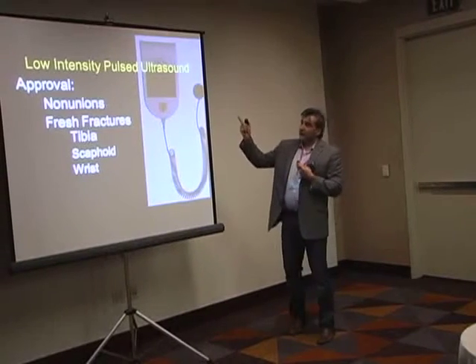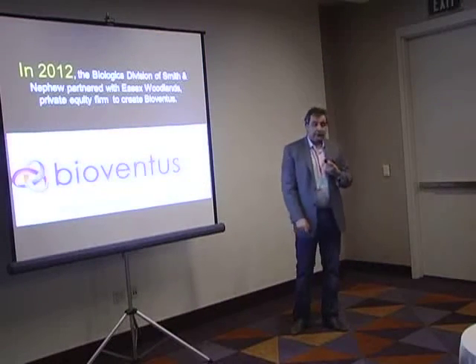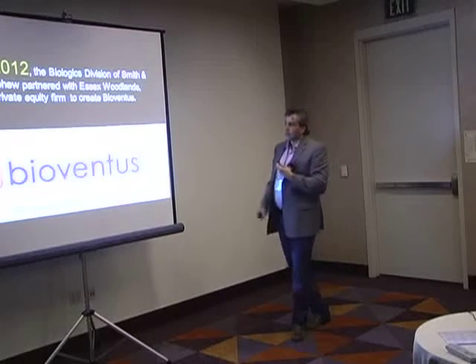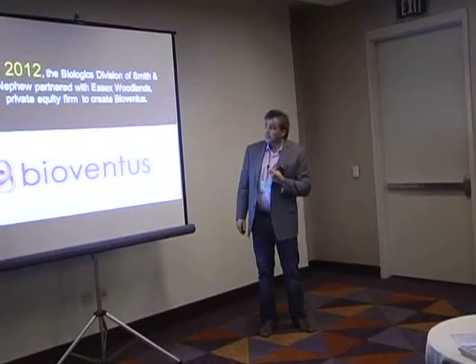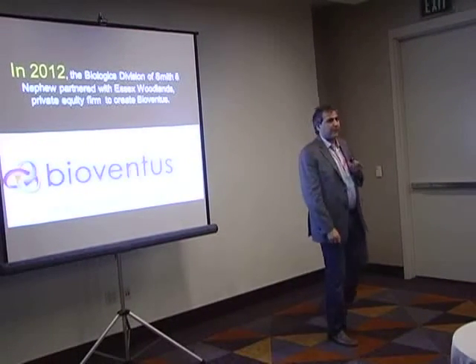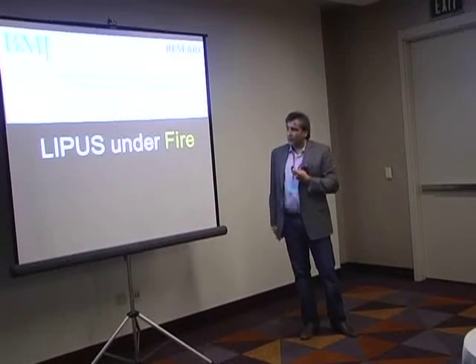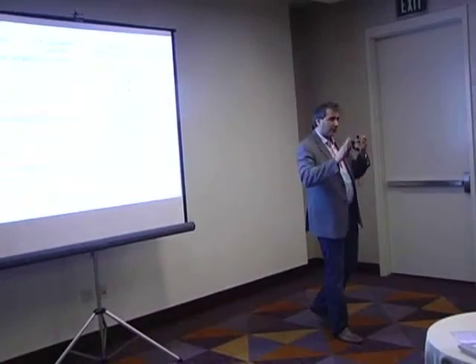So ultrasound has approvals for these indications. And just for clarification, we started a very large trial, about 500 patients, looking at the use of ultrasound versus a sham device in operatively treated tibial shaft fractures, IM nailed. Subsequently, during that period, there was a change in ownership or part ownership to Bioventus. And we've done some meta-analyses along the way.